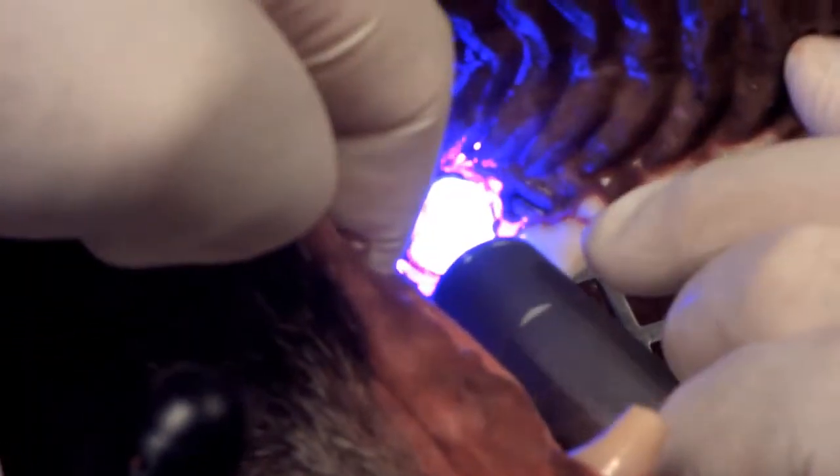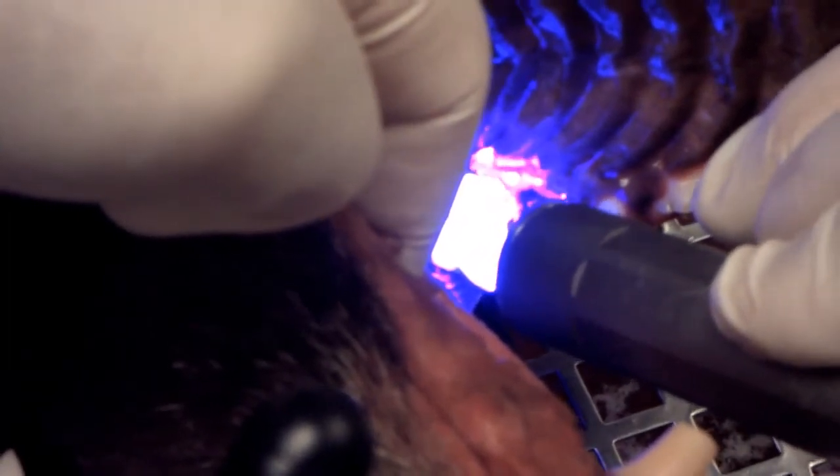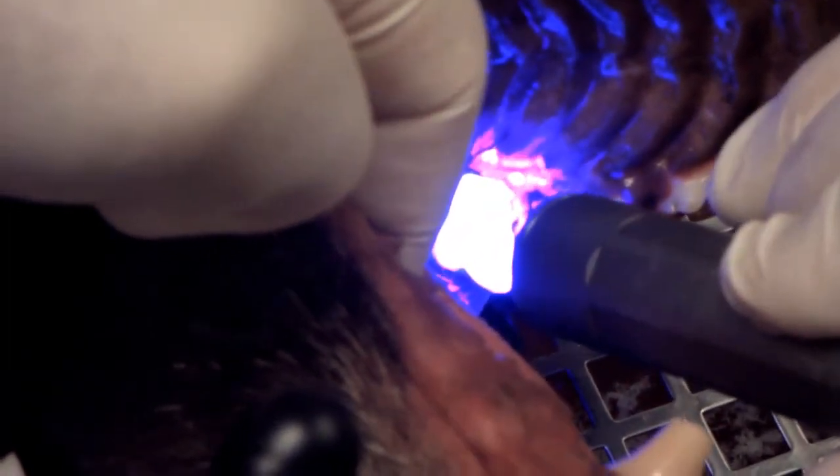I'm going to turn off my headlight and try some quantitative fluorescent light. I can see there's a little spot in there that's showing up a little bit darker, and that would indicate more decay, so I've got a little bit more drilling to do.